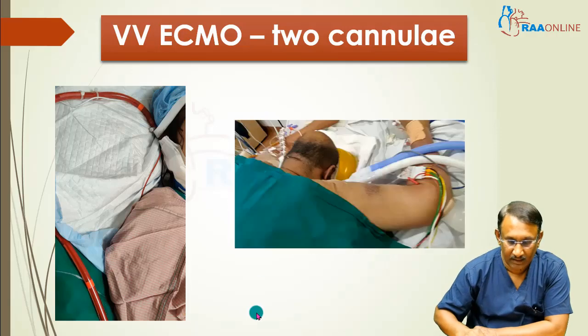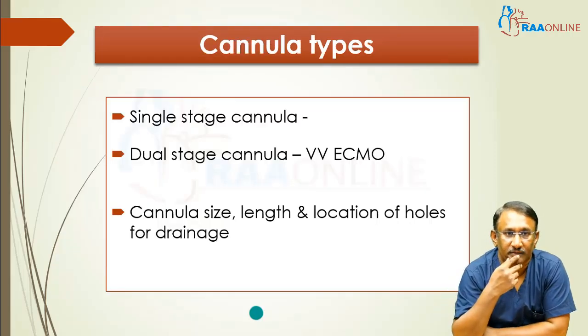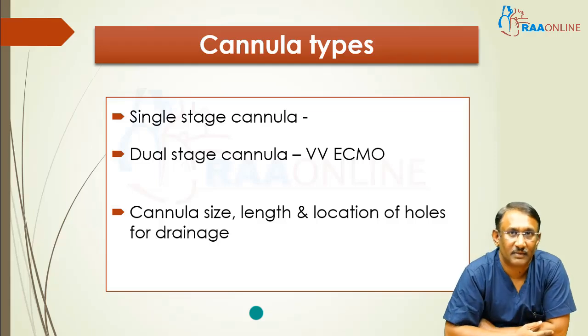Then, what are the different types of cannulas we have? We have two types of cannula. One, you have a single stage cannula. Single stage cannula means a cannula which works only as one. Either it can work as a drainage or it can work as a return. The second one is a dual stage cannula. Dual stage cannula means there is only one cannula through which you can use both as a drainage and as a return. This is used only for the veno-venous ECMO. You cannot use it for VA ECMO, VAV ECMO, all this. You can use it only for the VV ECMO.